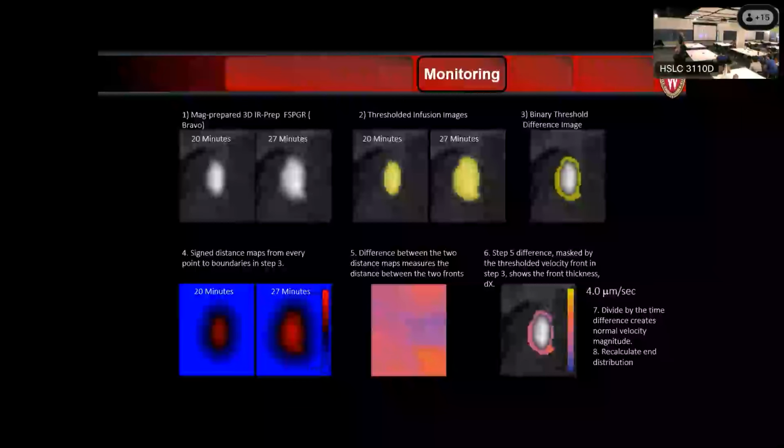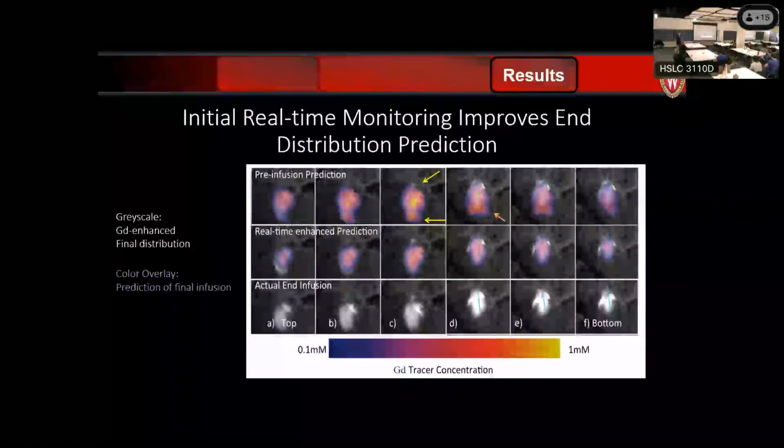where we would look at the infusion early on and see how it was growing. That created a 3D velocity field here shown in color about the infusion ball. And we could use that to basically use new high-end catheters, instead of just the catheters that are FDA approved today that leave infusate coming out from one tip, but from porous membranes that create wider distributions.